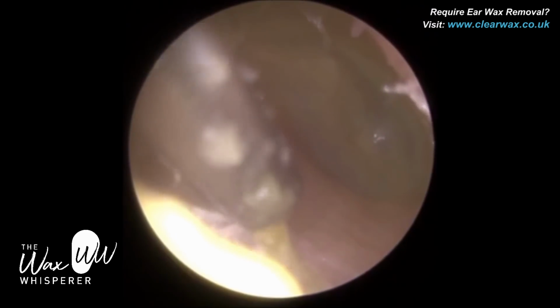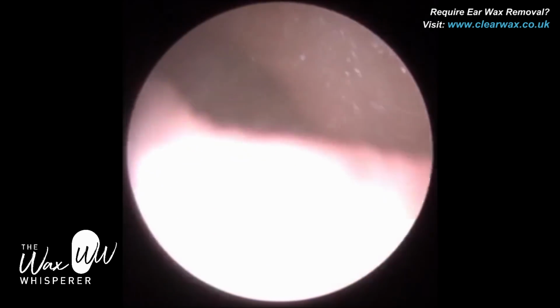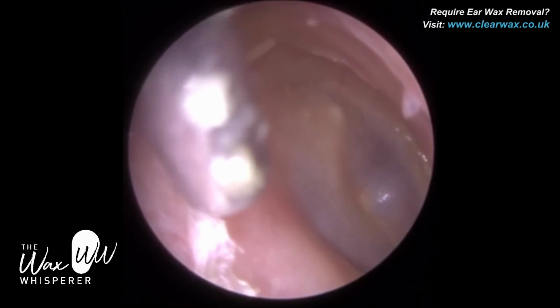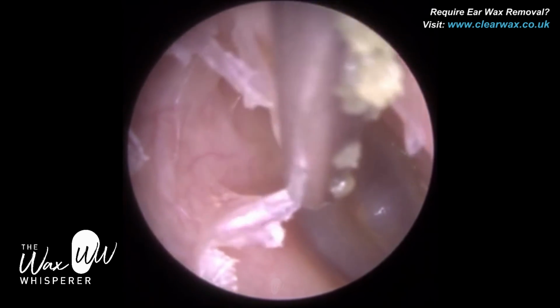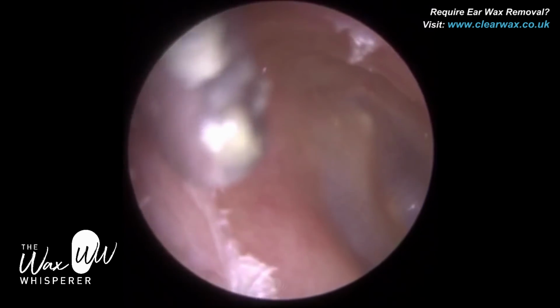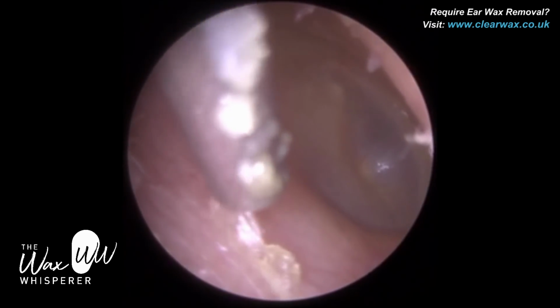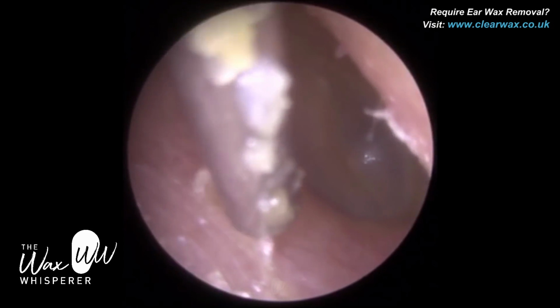The patient wears hearing aids as well, and when you've got a blocked ear, whether it be due to earwax or dead keratin in this case, the sound that's amplified into the ear by the hearing aid hits the wax or the dead skin and reflects back out of the ear canal, and that reflected sound re-enters the hearing aid microphone. Therefore the hearing aid re-amplifies the same sound, and once again that re-amplified sound enters the ear, hits the dead skin, reflects, bounces back out of the ear and re-enters the microphone again. And you have what we call a feedback loop, and that causes the hearing aid to squeal and whistle.